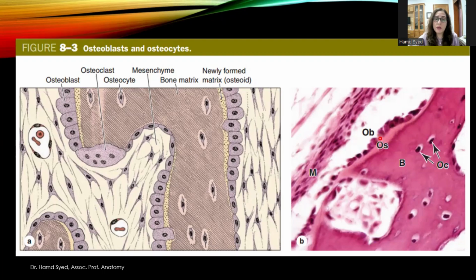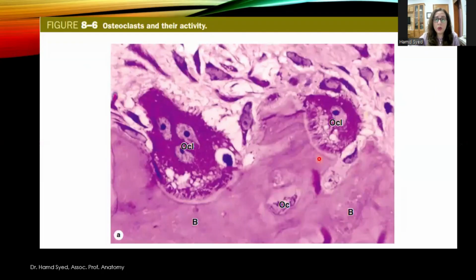And then here you've got the osteoblasts, which are lining the bony tissue. And here are the mesenchymal cells. Now the osteoclasts we can see over here in this histomicrograph. These are the large multinucleated cells, and they're present in these cavities, which are known as the Howship lacunae. And adjacent to them, you can see this here is the bone matrix.